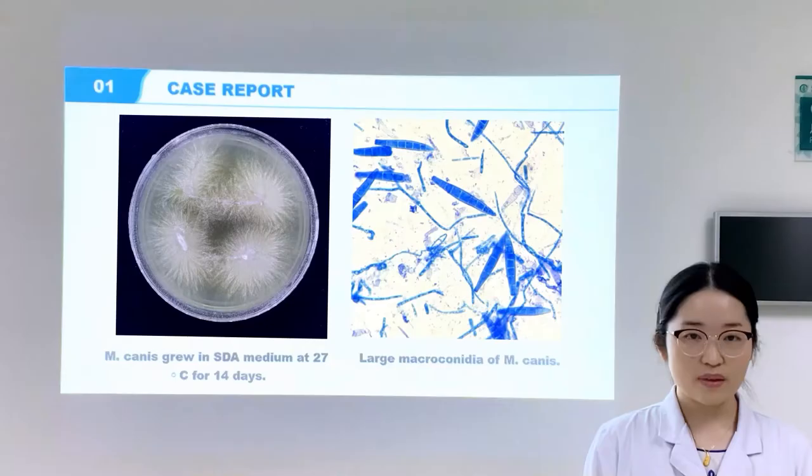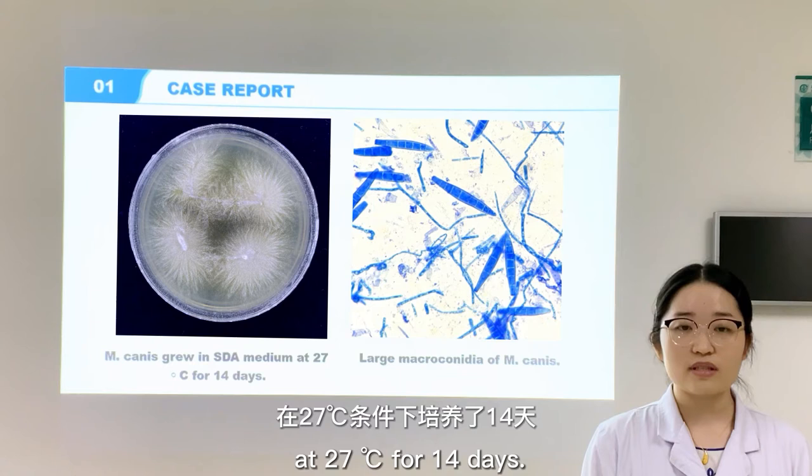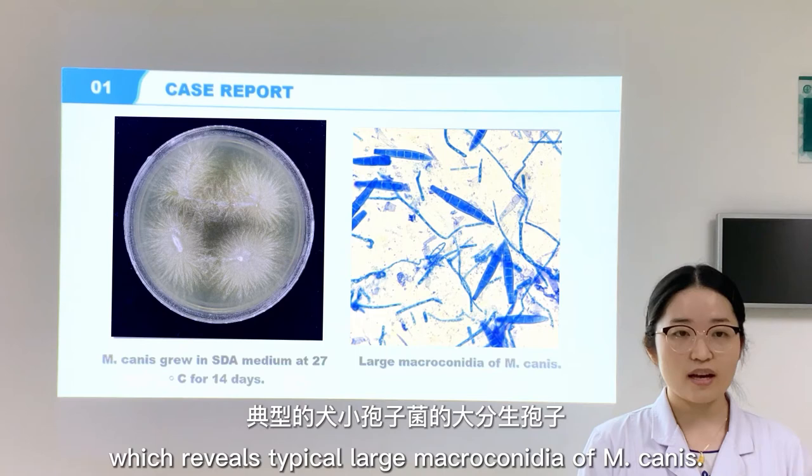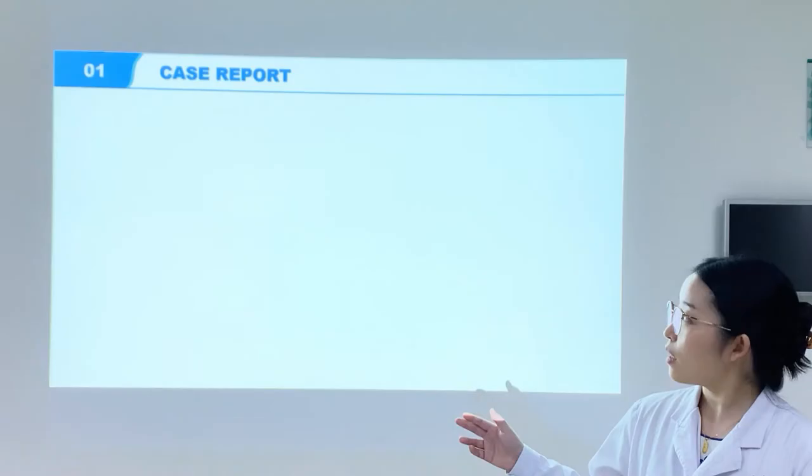We also cultured the lesional hairs on SDA medium at 27°C for 14 days. Yellow-colored colonies with radiating hyphae grew on the agar. This is the microscopy examination of the colony, which reveals typical large macroconidia of M. canis.